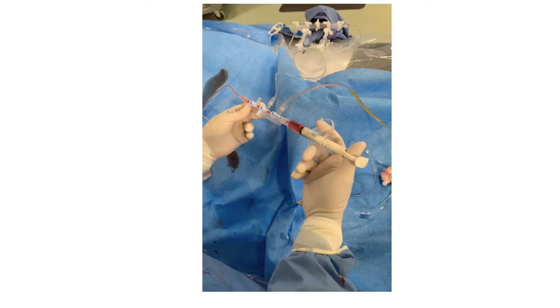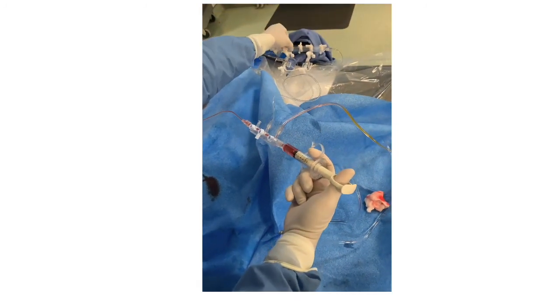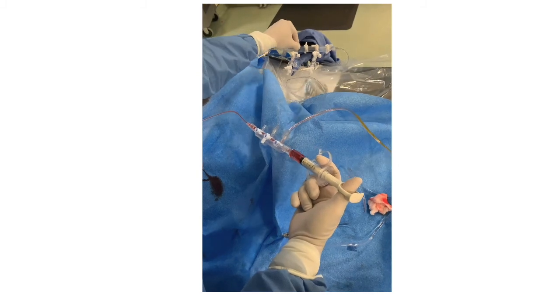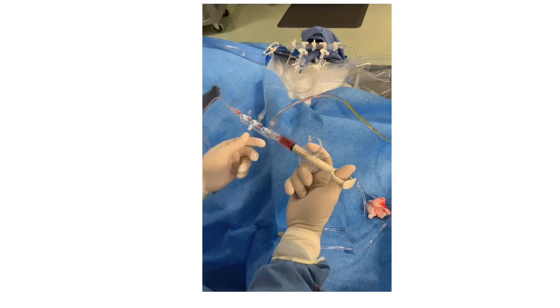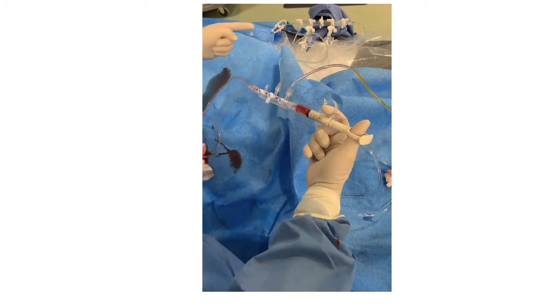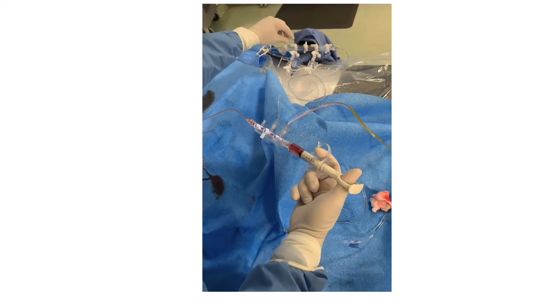Now let's see it all together, both manifold and transducer. The manifold is now at the default position. We're going to turn the transducer to zero there, turning it back to measure pressure. And we're now turning the saline valve away so that we can feed saline down towards our apparatus.